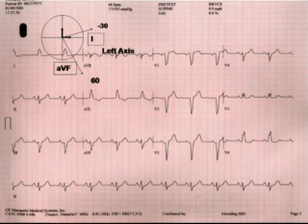Now I'll ask you again, what's the mean electrical axis? Well, to start with, is it normal or abnormal? Now, I told you that anything in the left upper quadrant was kind of a left axis. In truth, there are a lot of non-cardiac diseases like obesity that can shift the axis slightly because of a shift anatomically. And an axis between 0 and minus 30 degrees is seen very frequently in non-cardiac illness. So minus 30 is kind of set as the threshold for pathologically abnormal axis.